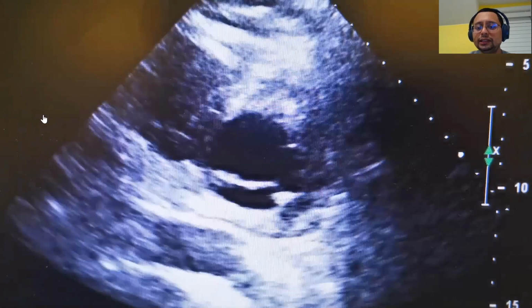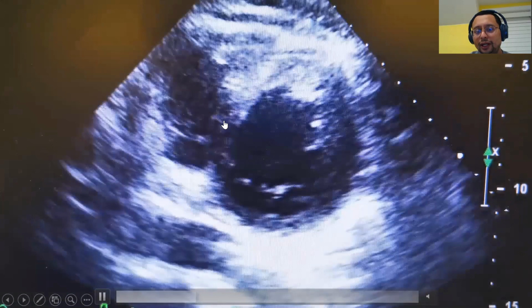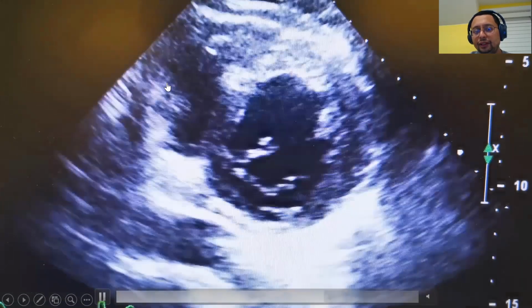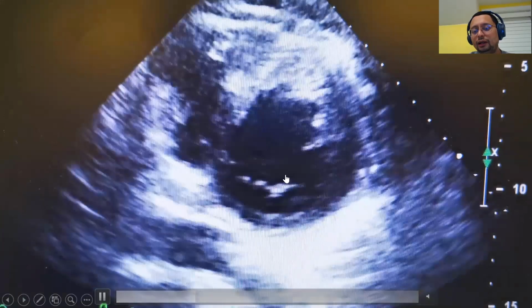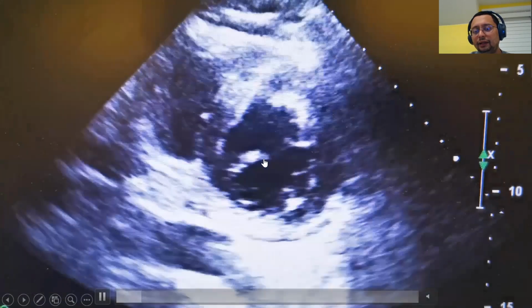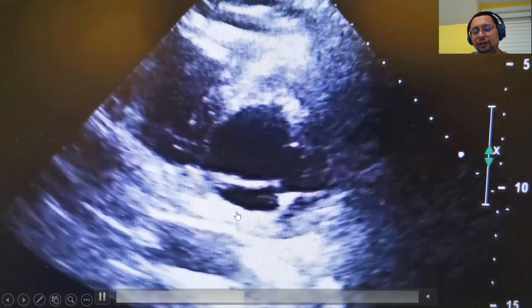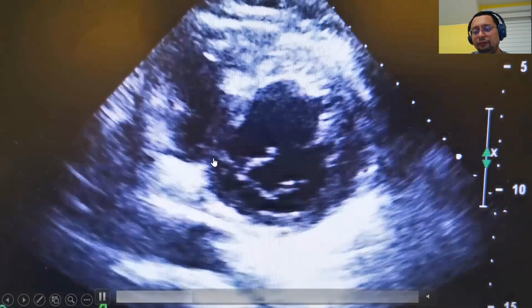Okay, so this is just a short axis view. This is the mitral level. Look at that. You have a right ventricle there, so this must be the septum. Whenever you see the mitral valve, this must be basal. So this is basal anterior, that is basal inferior, that is basal anteroseptal, this is basal inferoseptal.